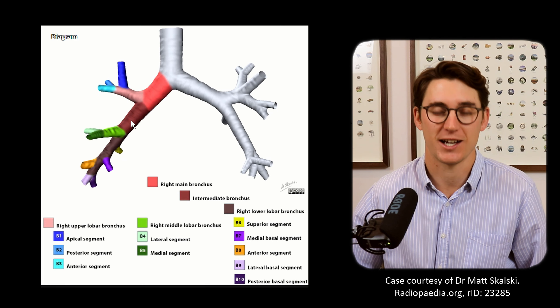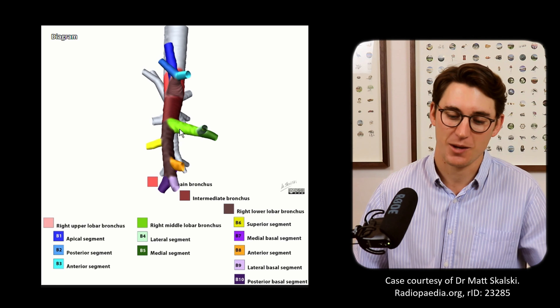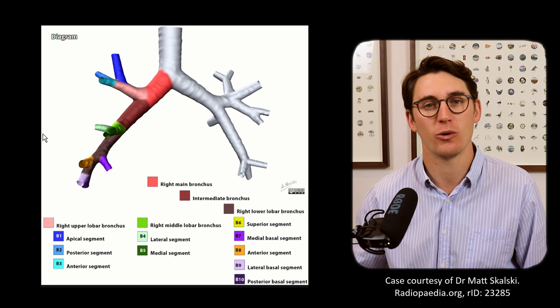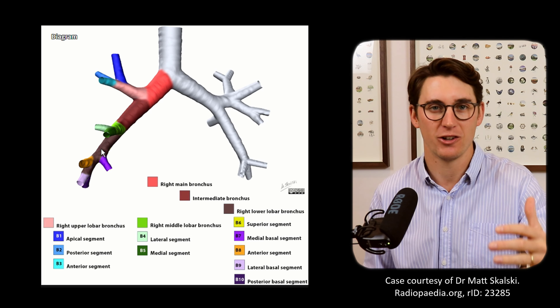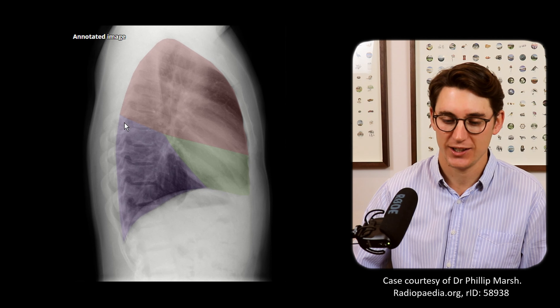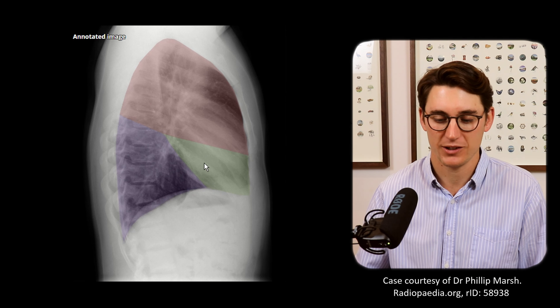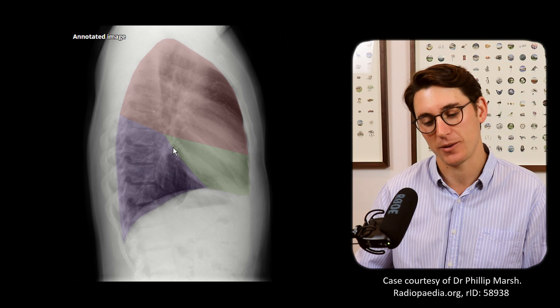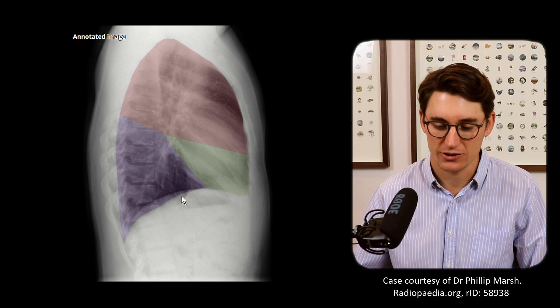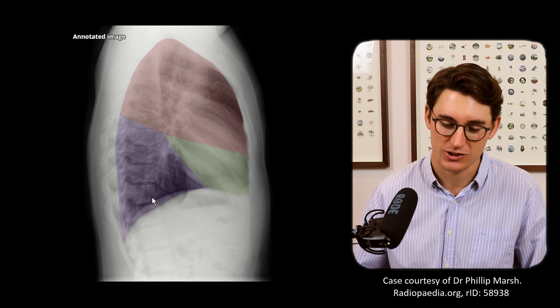Following our bronchus intermedius down, we have our right middle lobe bronchus coming anteriorly. It's helpful to think of the upper lobe as superior, and the middle and lower lobes as inferior — the middle lobe being essentially an anterior lobe and the lower lobe a posterior lobe. On a lateral chest X-ray you can see why the middle lobe bronchus branches forward while the lower lobe bronchus heads posteriorly, and why the posterior lung extends much further inferiorly than the anterior portion.